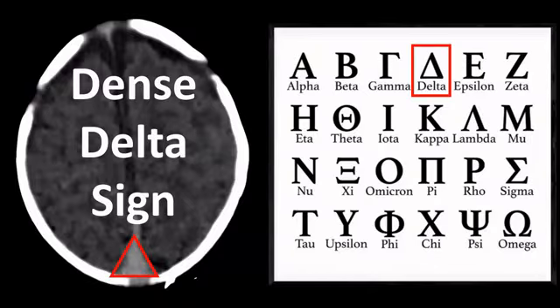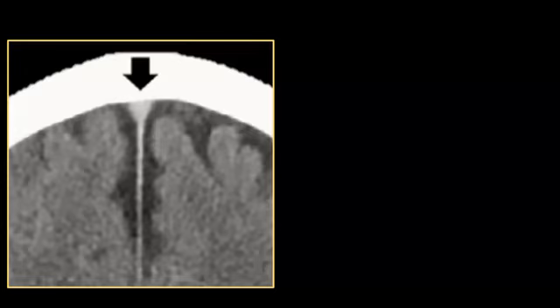This can sometimes make the world of radiological signs a bit confusing, if you ask me, because it's like a sport in radiology to have your own sign published. So I often refer to the delta sign as a sign involving a thrombosis of the posterior part. That's because the anterior part doesn't really look like a delta, or it looks like an inverted delta.